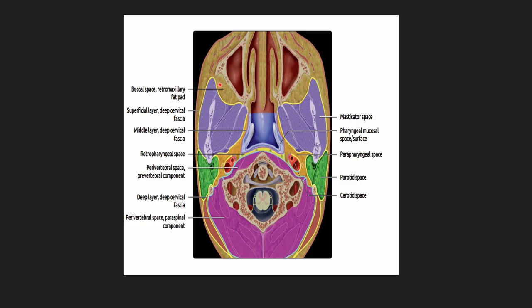The superficial or investing layer of deep cervical fascia encloses the masticator and the parotid space, and posteriorly it splits to enclose the trapezius and the sternocleidomastoid. The middle or visceral layer of deep cervical fascia encloses the pharyngeal mucosal space and the visceral space in the infrahyoid compartment. Posteriorly we have the deep or perivertebral fascia which encloses the prevertebral and paraspinous muscles.